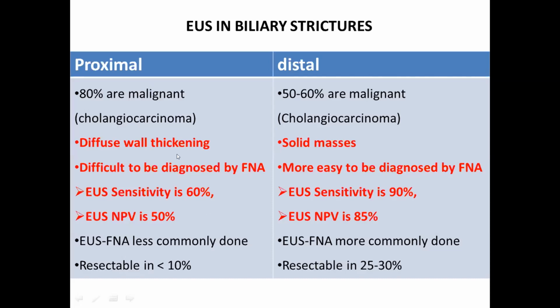So here the modality of choice after doing MRCP and MRI is cholangioscope and spyglass. Or during ERCP, we can do bile cytology or brush cytology. This is in contrast to the distal CBD stricture.